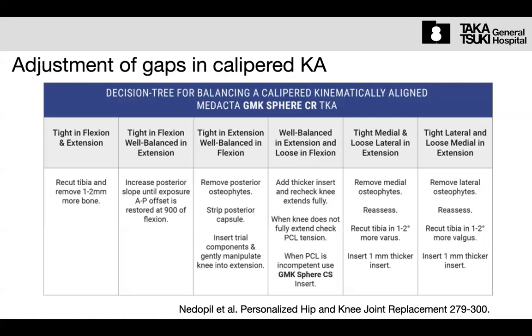Or maybe in most cases, especially for the patient with the flexion contracture preoperatively, most patients have a tightened, contracted posterior capsule. So once we detach the posterior capsule, we can extend fully or insert in extension.